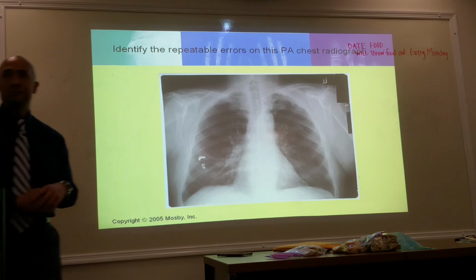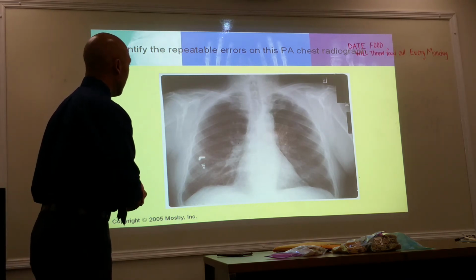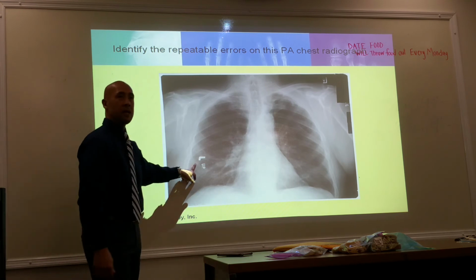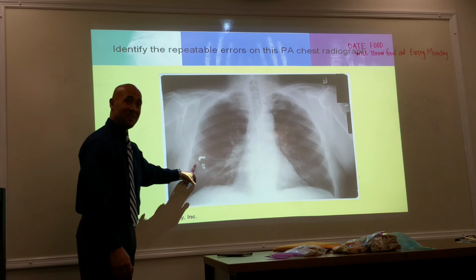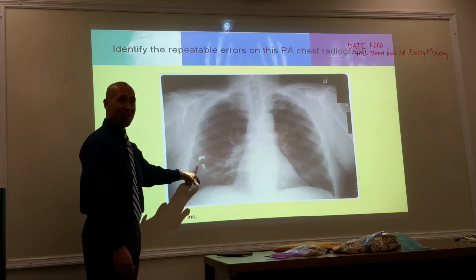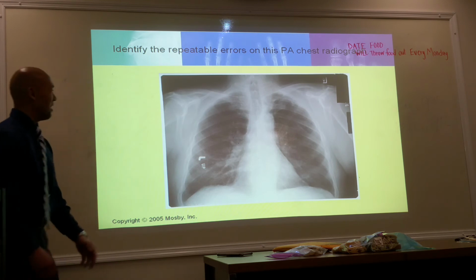How about this one? What the marker? What the heck? He swallowed a marker. Oh yeah, it's on the wrong side. This should be a right. It's in the field. That shouldn't be there. Okay, that wasn't obvious.